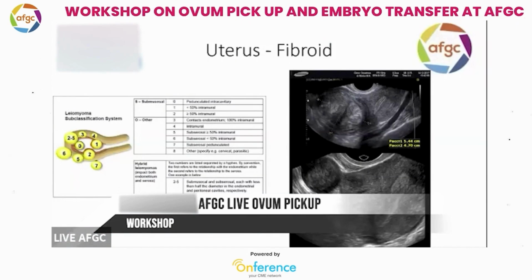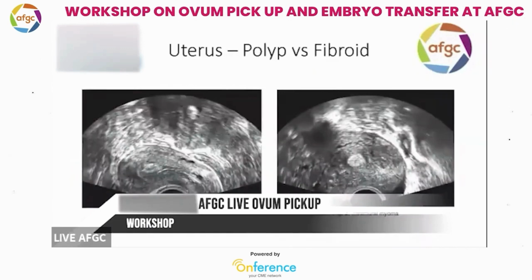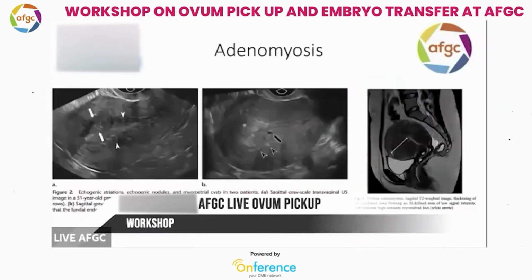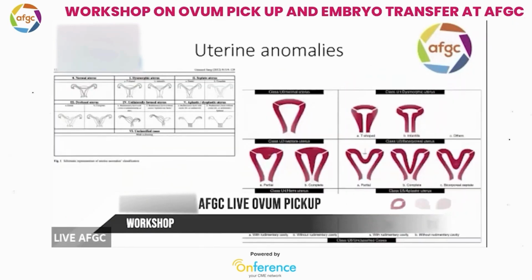So now we are almost at the end of our demonstration. Let me just quickly go through the uterine anomalies.